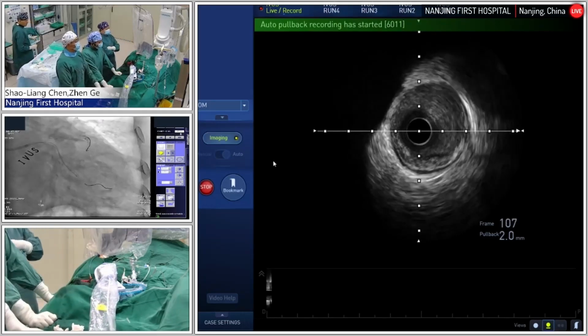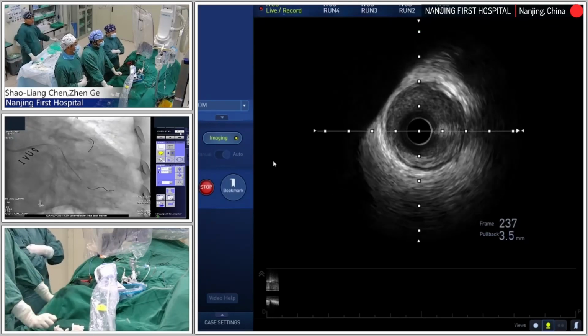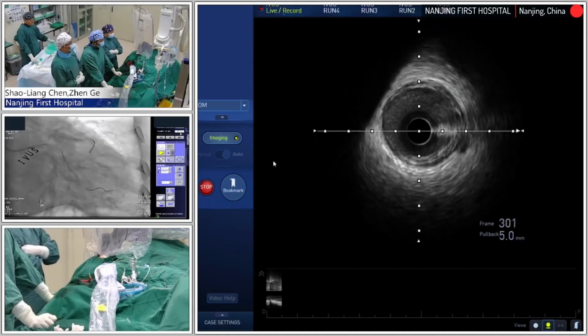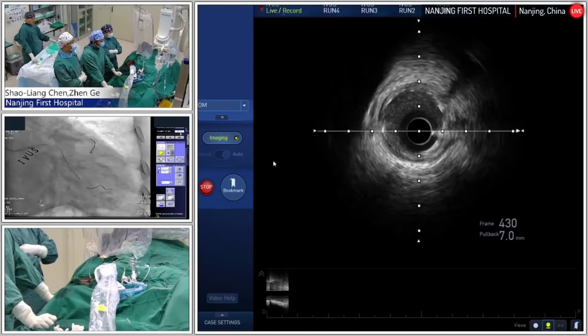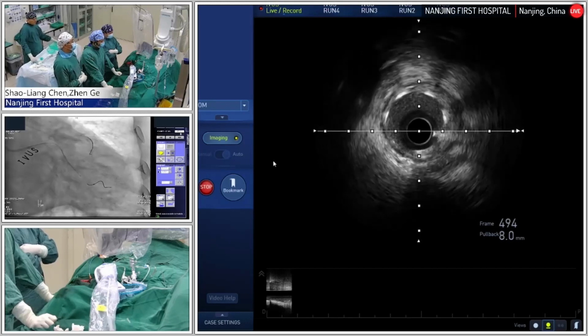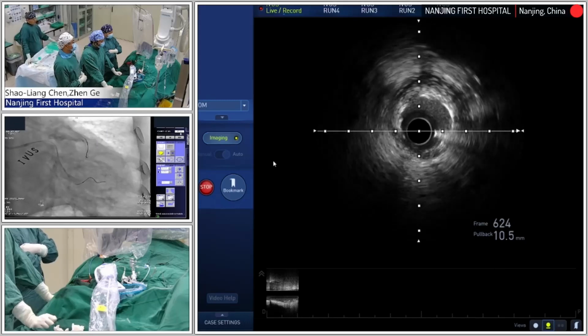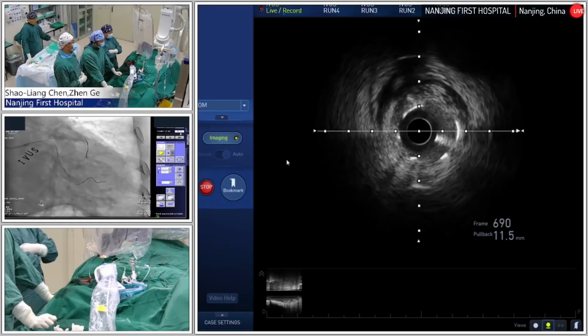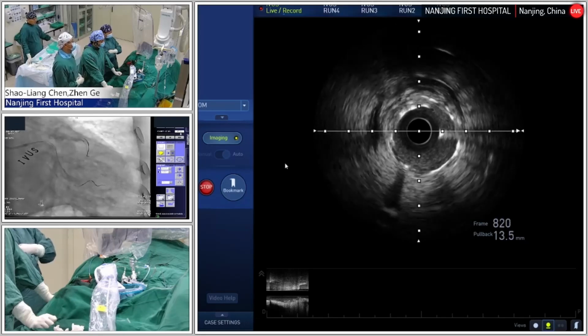It's the OM. The normal. So distal is 3.0, a little bit larger than 3.0. The distal stent edge is normal. It's beautiful. No dissection. Normal. Beautiful. Distal stent diameter is maybe 2.5. Not very large.